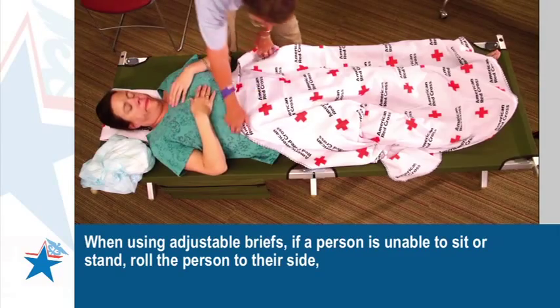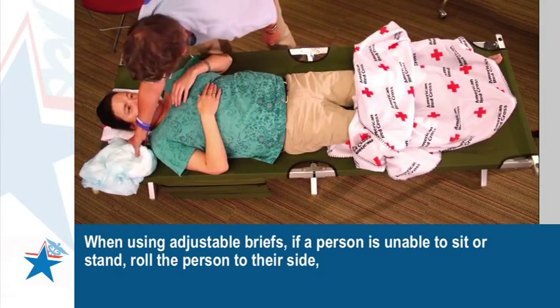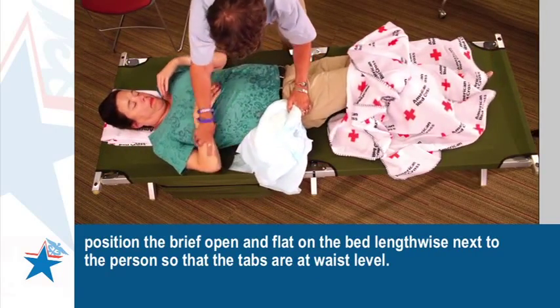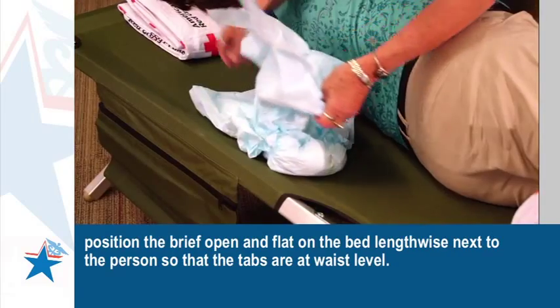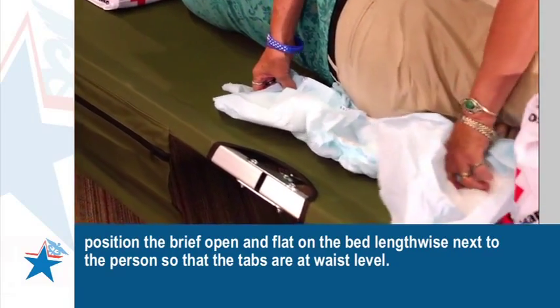When using adjustable briefs, if a person is unable to sit or stand, roll the person to their side. Position the brief open and flat on the bed lengthwise next to the person so that the tabs are at waist level.